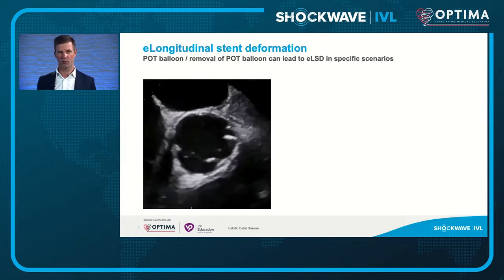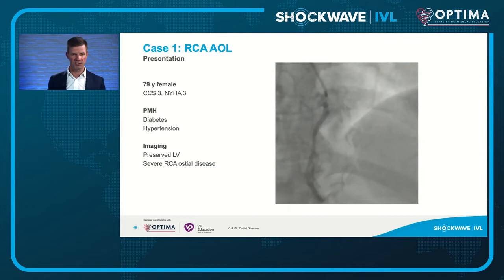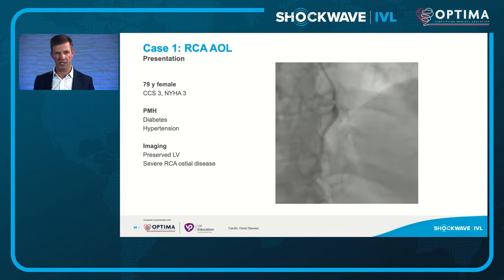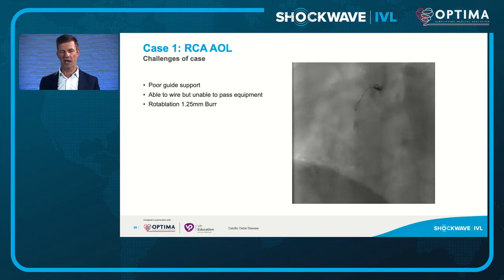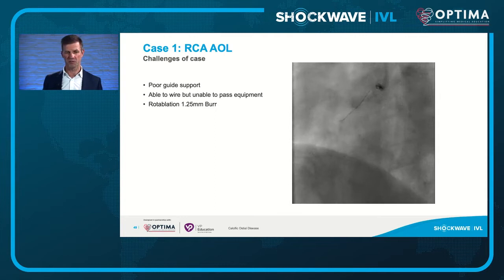First case: a 79-year-old lady with ongoing symptoms, diabetes, hypertension, and preserved LV function. Her diagnostic coronary angiogram shows a severe right coronary artery lesion. There's poor guide support — typical for aorto-osteal lesions. Unable to deliver anything on a workhorse wire, I move to a Rotafloppy wire, and unable to cross the lesion with any devices I proceed to rotablation using a 1.25 millimeter burr.